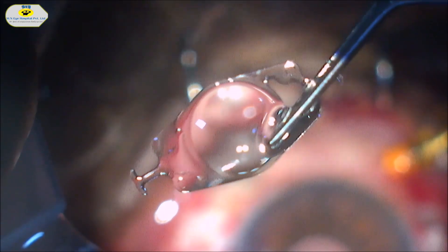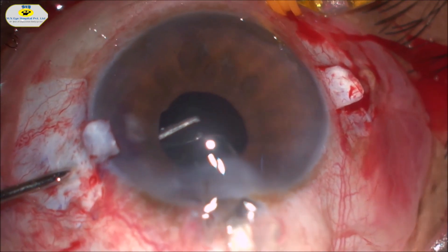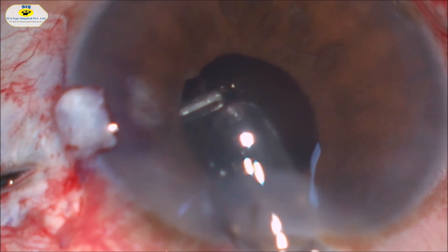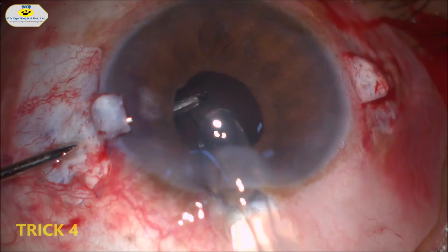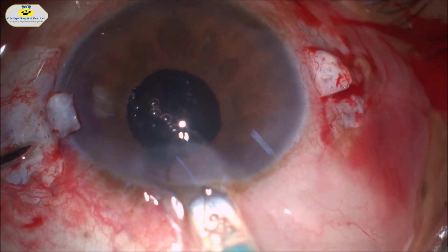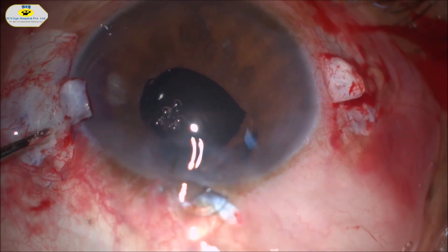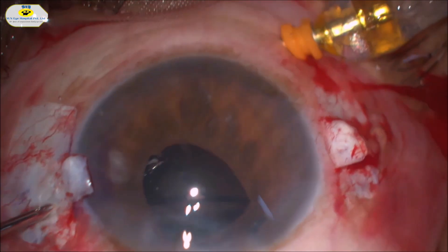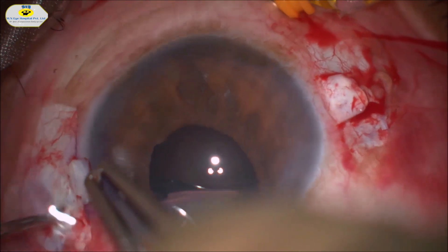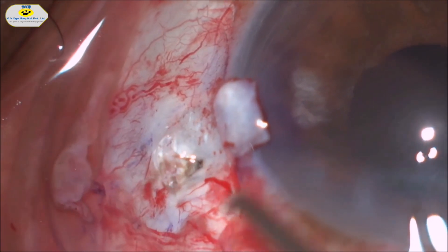This is the scleral fixating CM T-flex IOL. The T-flex IOL is injected slowly through the main corneal incision and held head-down with the forceps at the T-junction. Once the IOL is injected, the T-junction is brought out with the forceps through the sclerostomy site. The pop of the T-flex emerging out can be appreciated.